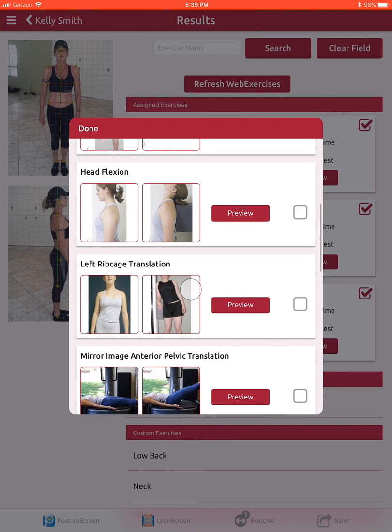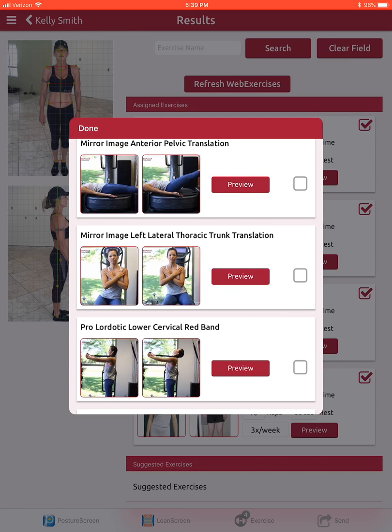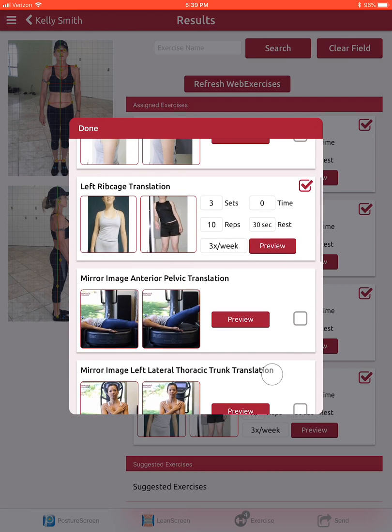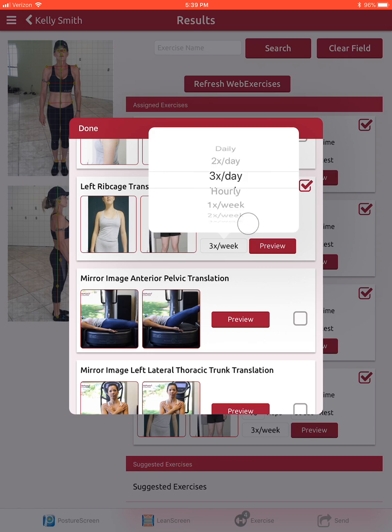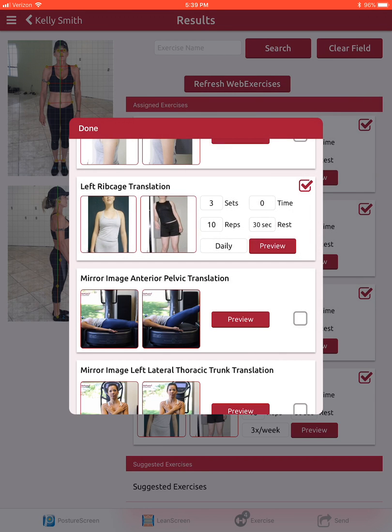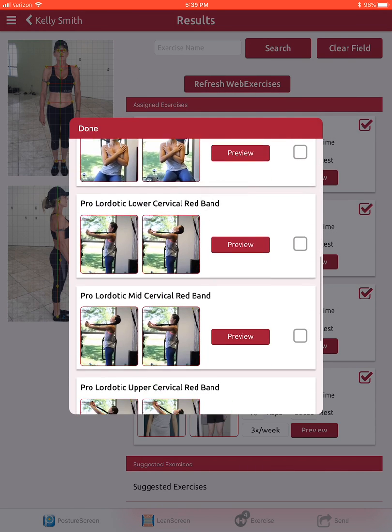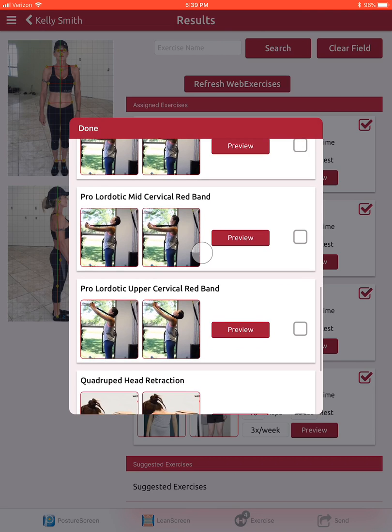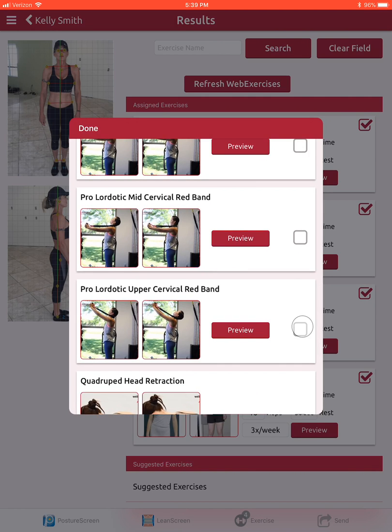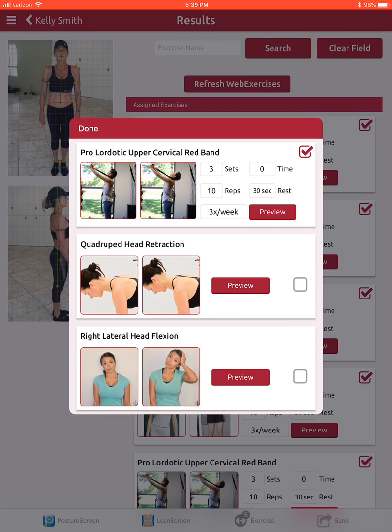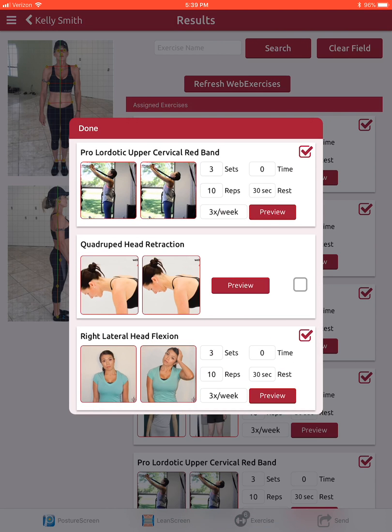Since they have a trunk shift to the left, we're going to do a corrective exercise to the right and have them do this daily. We'll also add a pro-lordotic exercise as well as an exercise for the lateral head flexion.